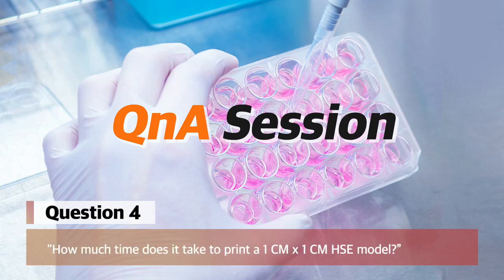So how much time does it take to print a 1 cm by 1 cm HSE model, which would be 10 millimeters by 10 millimeters? This would depend really on the printing speed that you give to the printer, and this is a common question we get when it comes to 3D printing itself. But let's say you are using a standard way of experiments, a 10 by 10 millimeter HSE could be printed within about 30 minutes, depending on the number of layers that you put.